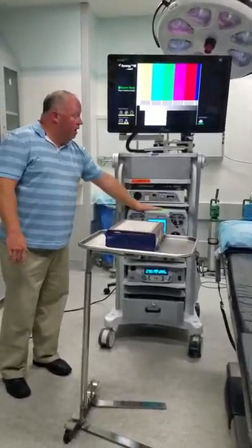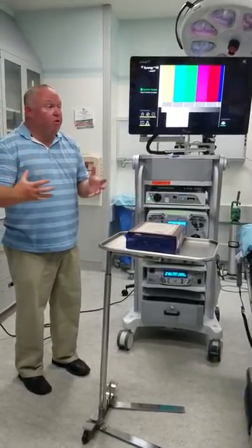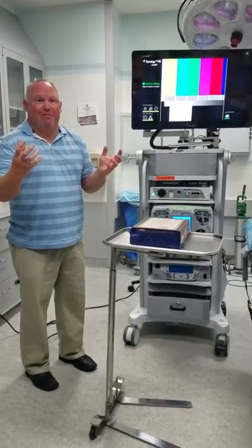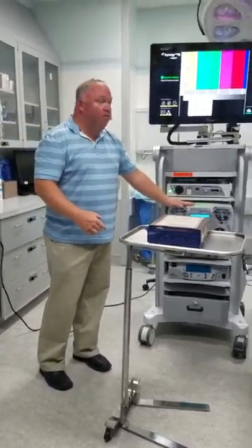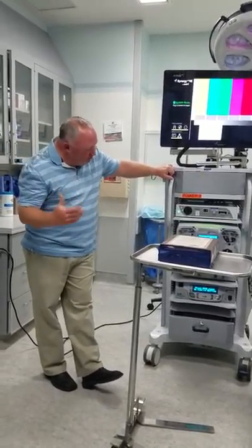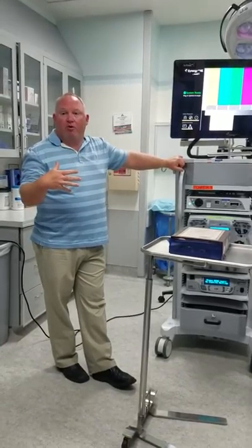This is a pump. What the pump does, again, for a scope in any joint, you need fluid. You need fluid to expand the joint. You want the joint to be as big as it can be. So that being said, this pumps fluid. So it allows you to say, I want 40, I want 50, or I think it's a little pressure, where it might be. But anyways, you can regulate how much you want.